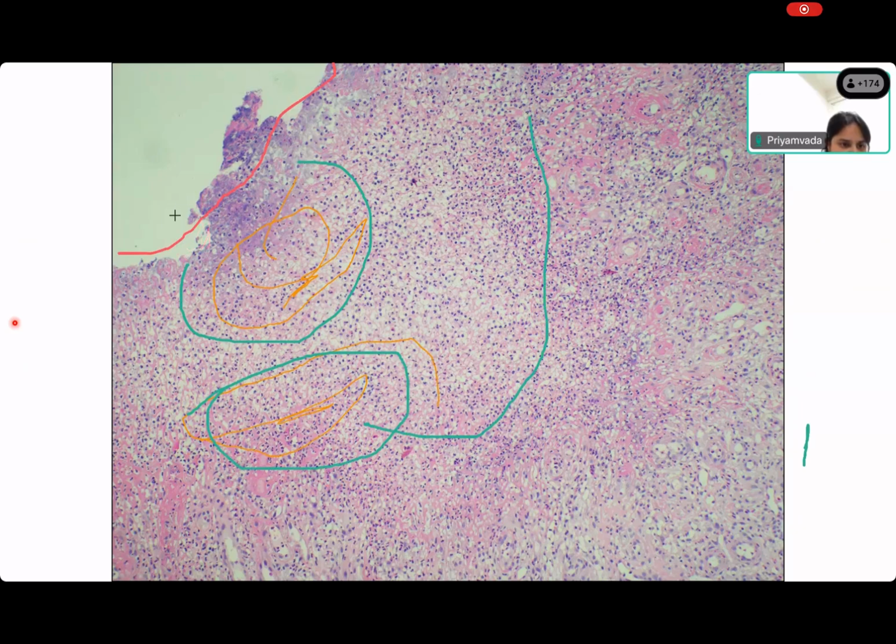Color. Oh, there. Acha, she's used this on top. Is this what you're saying? Is the base of the ulcer? Yeah, yes, this Priyambada? What have you drawn now? This one, ma'am. This one. Where? Ma'am, 1 minute. I'll use the color. I know what you've done, Priyambada, because your name comes up here. Yes, I know. What you're saying is the base of the ulcer.